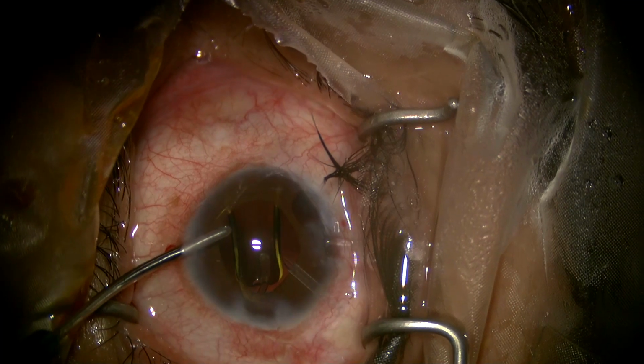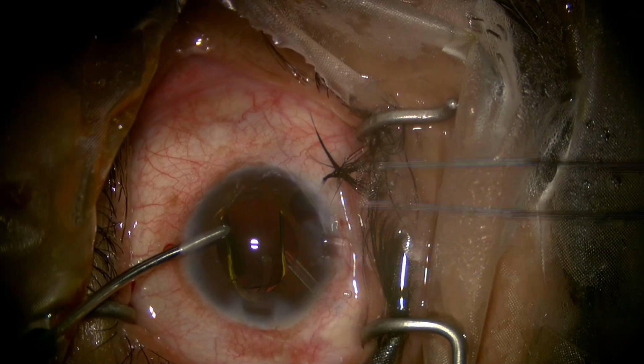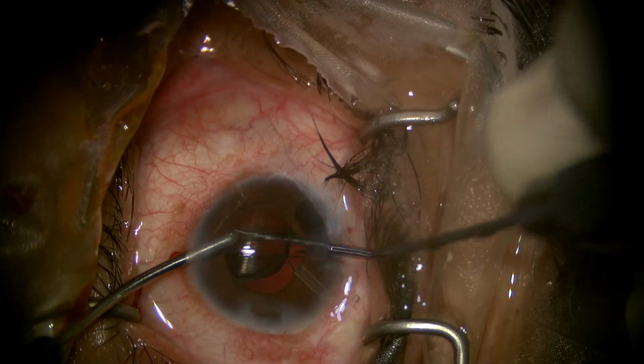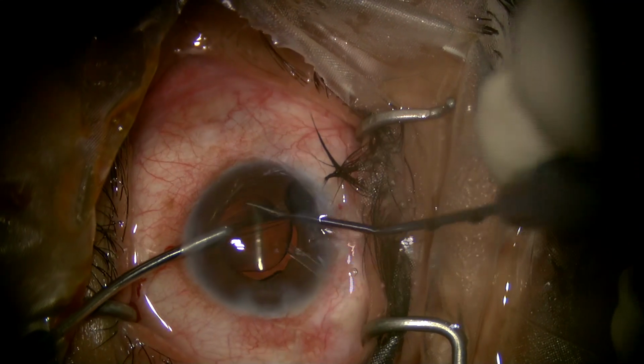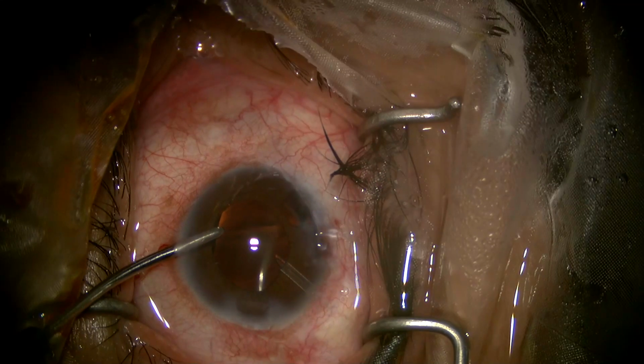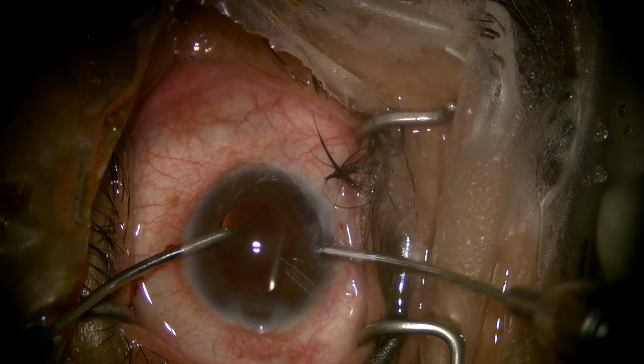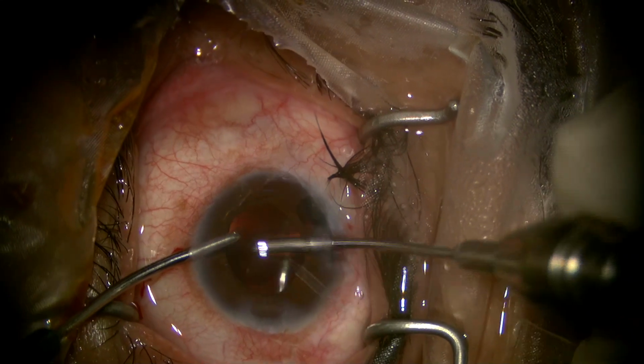We can see under irrigation the IOL is implanted. Now it will be dialed into the bag with the help of a Y. So the surgery is done. Routine hydro closure of the wounds will be done.